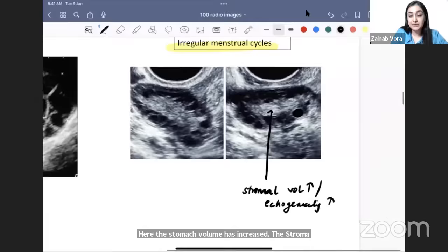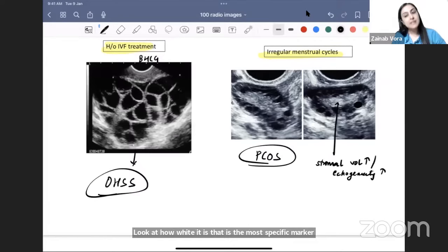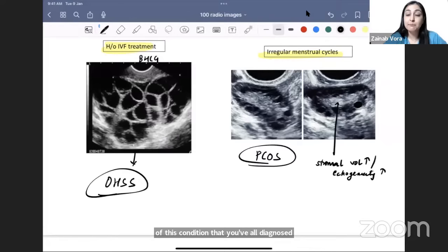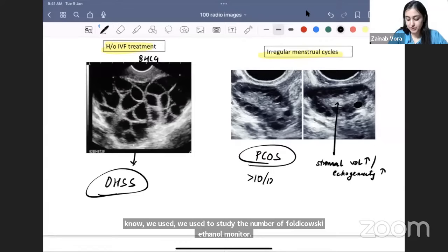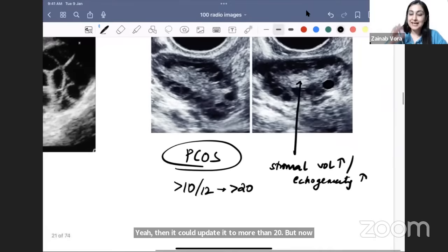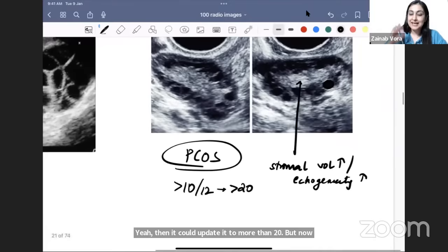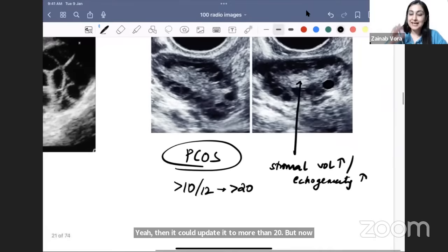An irregular menstrual cycle without IVF history, with small follicles arranged in the periphery — more striking than the follicles is the stroma: the stromal volume is increased and stromal echogenicity is markedly increased (very white). This is the most specific marker of PCOS. Earlier, we counted follicles — more than 10, then 12, then 20 — but now guidelines say don't even count; just note multiple peripheral follicles and, crucially, increased stromal volume and echogenicity.